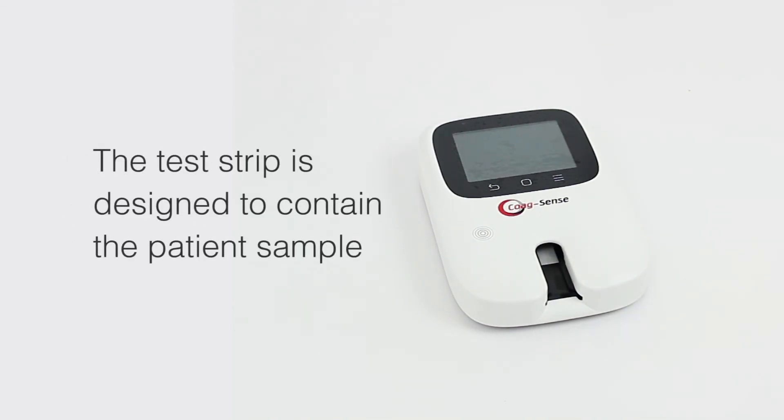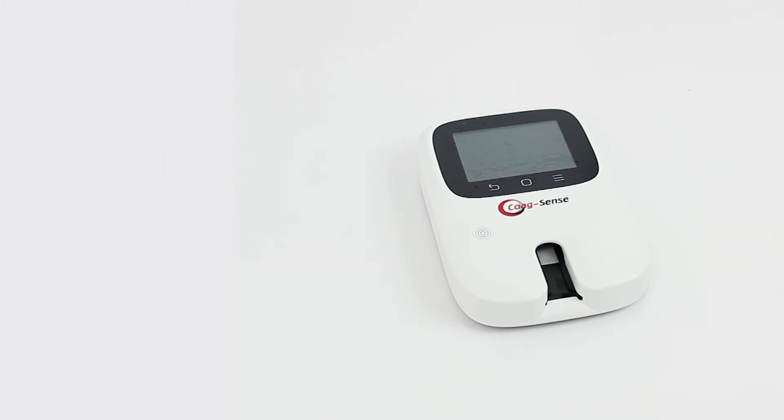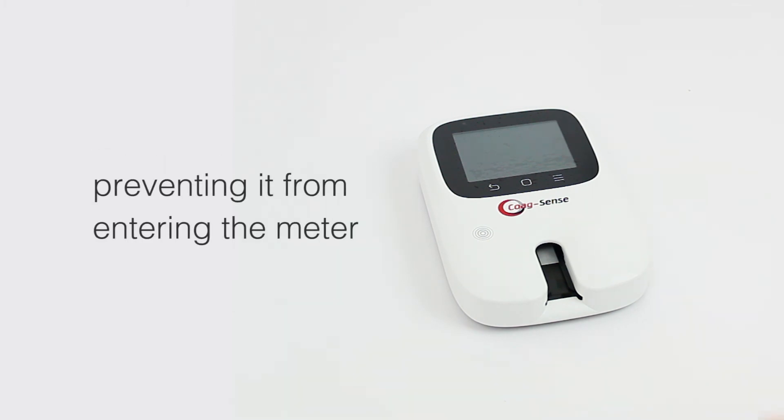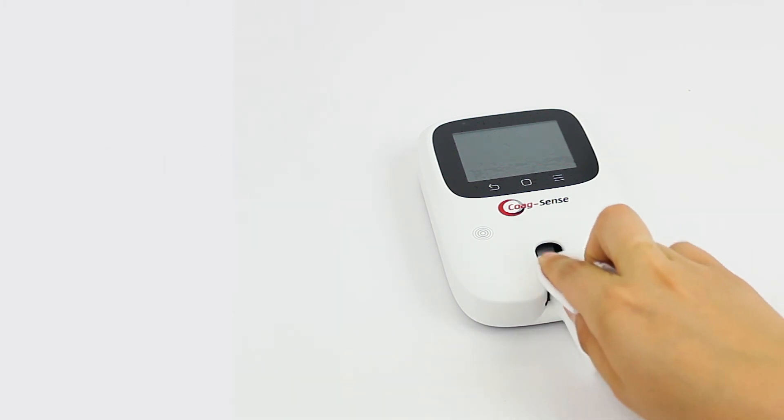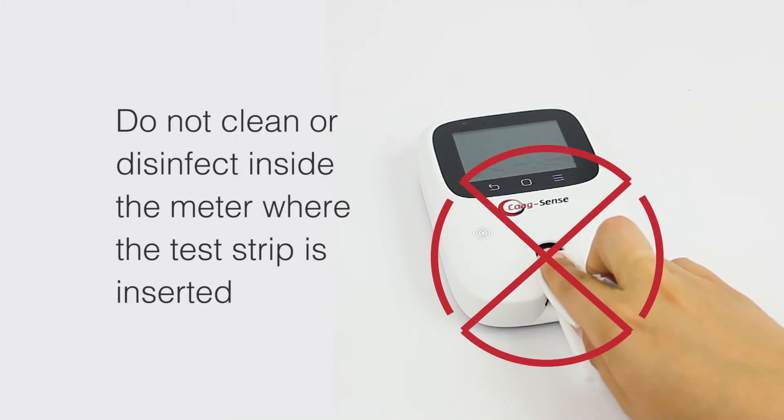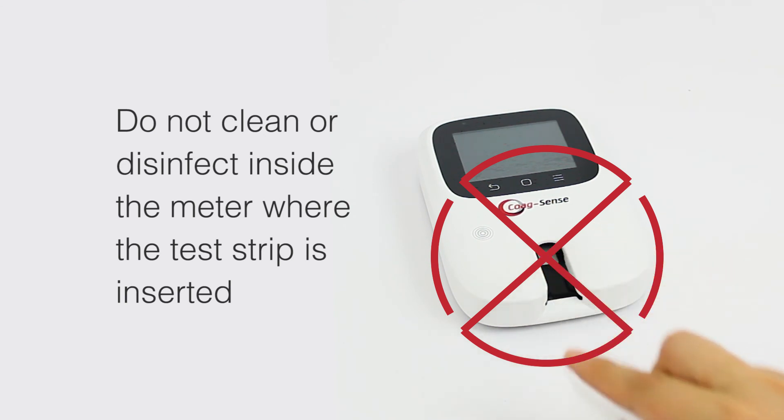The test strip is designed to contain the patient sample, preventing it from entering the meter. Do not clean or disinfect inside the meter where the test strip is inserted. Cleaning this area should be avoided.